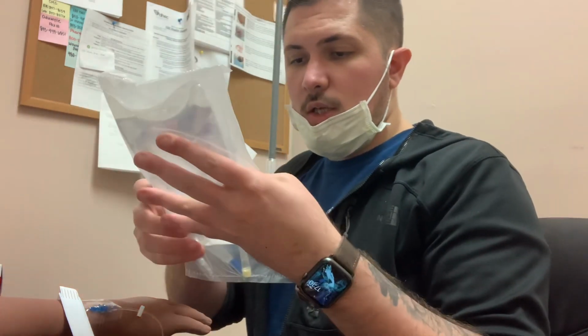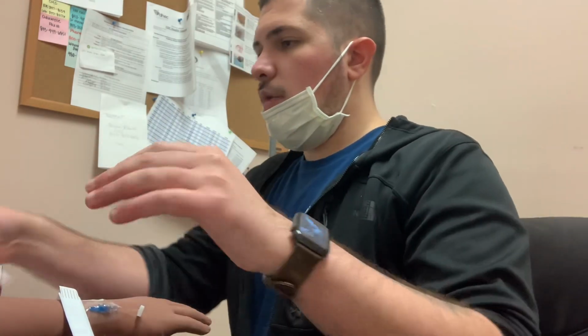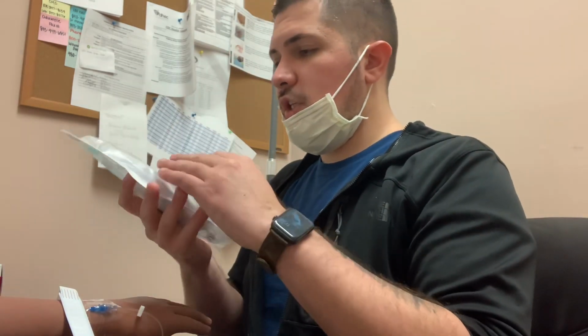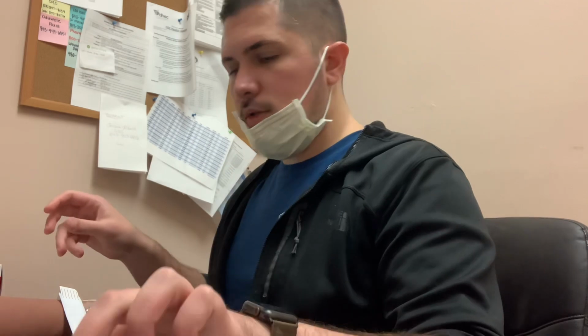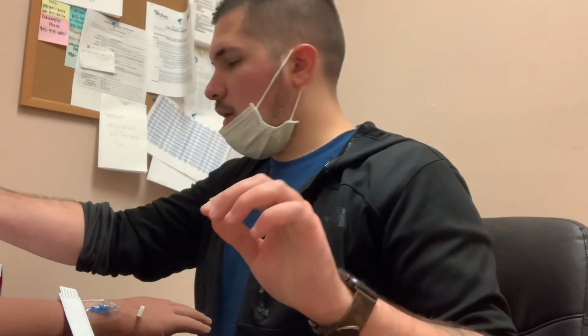It's within date. It is not expired. We got our administration set. It's not expired. We have alcohol supplies, labels for the IV tubing, and we have gloves.